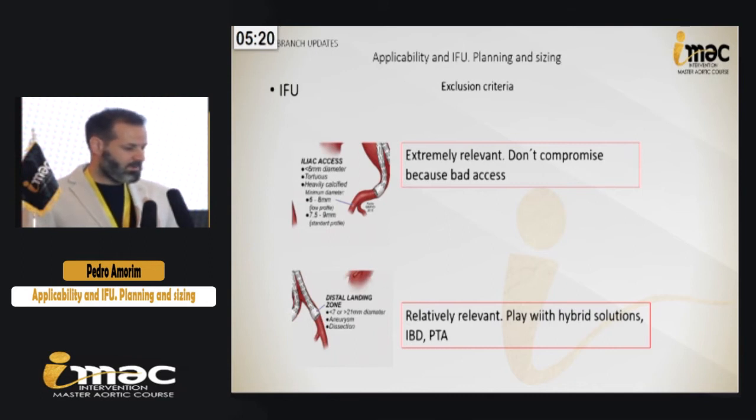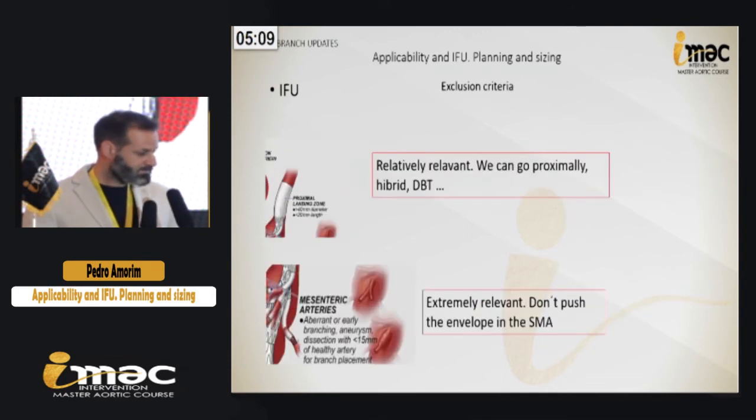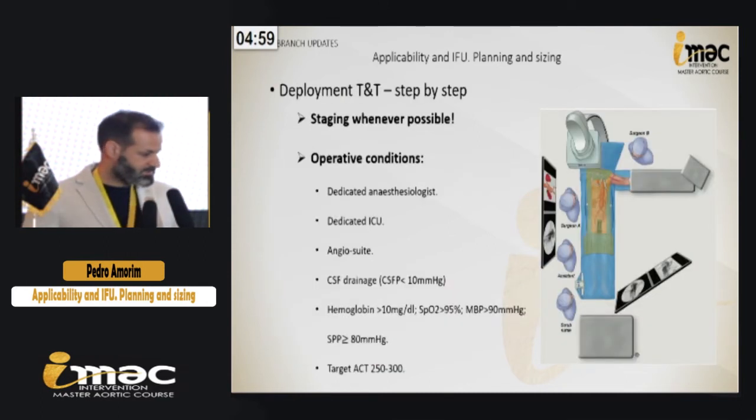And one of the biggest and most relevant aspects is the access, as we will see in the next talks. To avoid complications, we sometimes need to prepare a good access. And of course, extremely relevant too is do not push the envelope with the SMA. Every exclusion criterion in the SMA is to be taken into account.